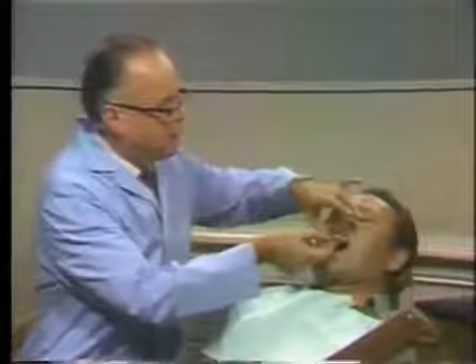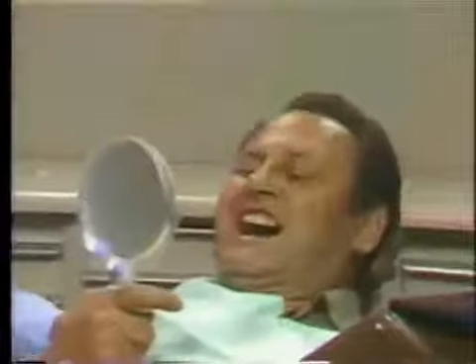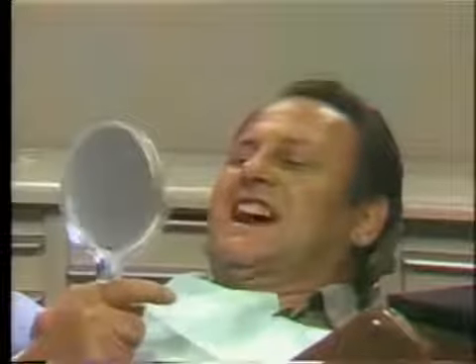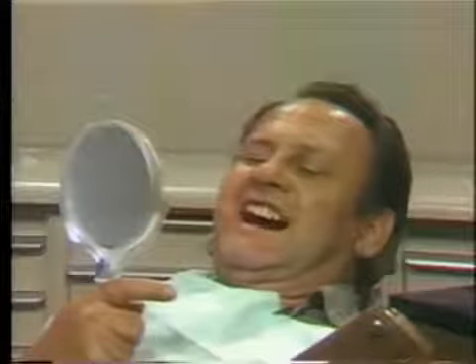Now we'll place this in position in the mouth. And check it for shade. Now we'll give our patient a hand mirror, and he can take a look at the situation and see how it appears to him. How does that look to you, Mr. Steinhauser? Looks good.